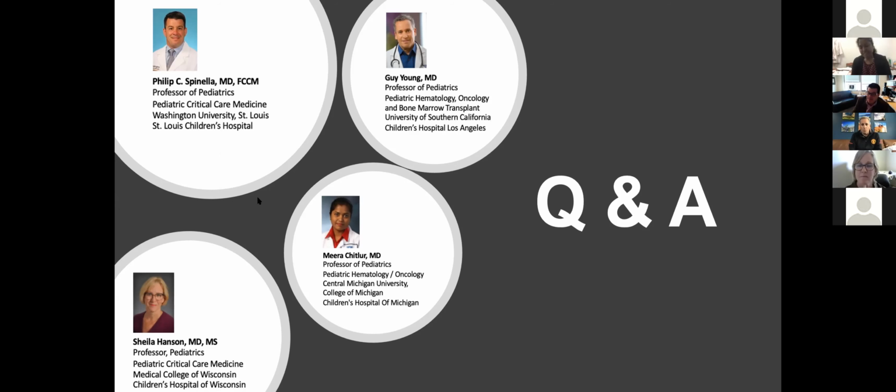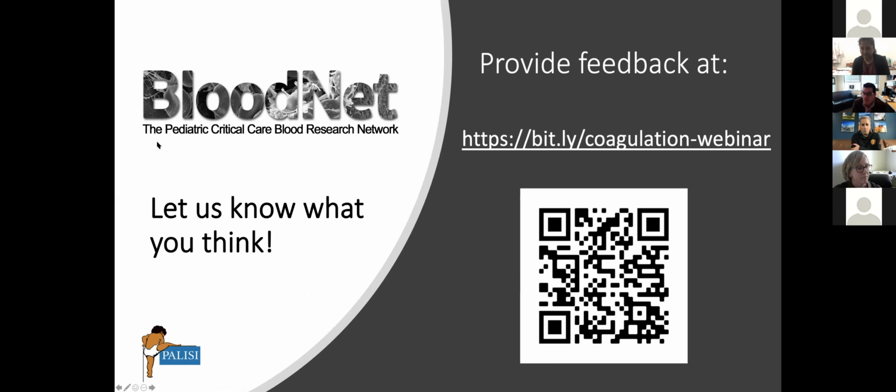Okay. So in bleeding patients, we do use a combination of tests. We do measure the fibrinogen. You will measure the PT-PTT. We will also get a TEG to see if we can understand what this combination of lack of factors or platelets is doing to the whole coagulation system. When a patient is bleeding, it becomes quite complicated in that you have to make sure you understand the whole scenario and the underlying clinical condition that's causing all this bleeding. So a combination of tests is what I would prefer to use rather than one test.